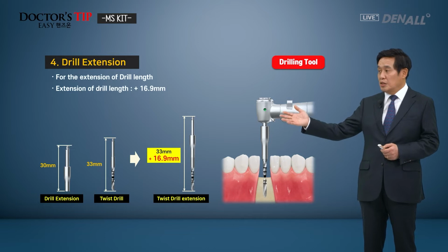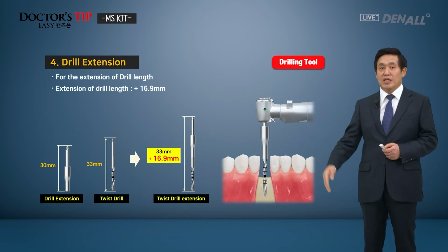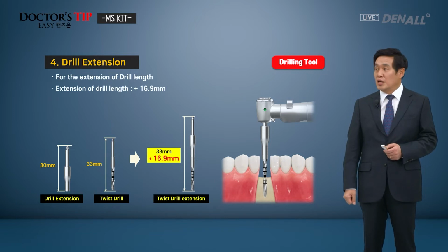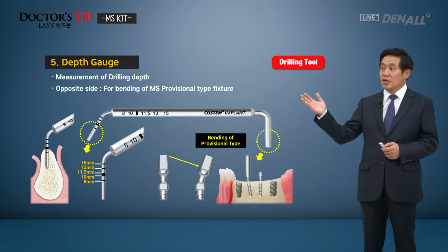The extruded teeth have a lot of bone absorption. There could be more interference. So if you use the drill extension in such cases, drilling will become easier. Next is the depth gauge. It's a basic gauge that you would know, but it's a bit narrower and thinner because you go into a narrow space.